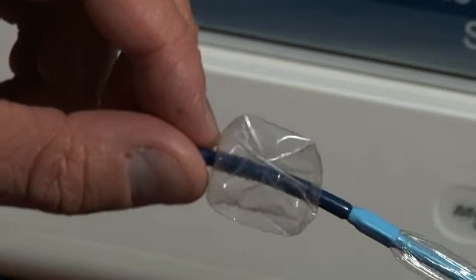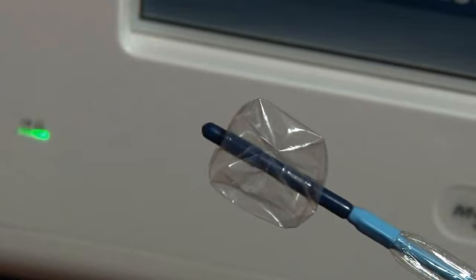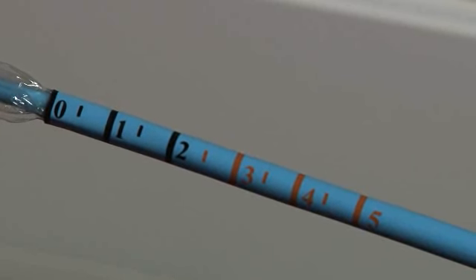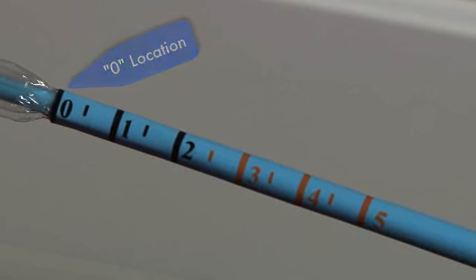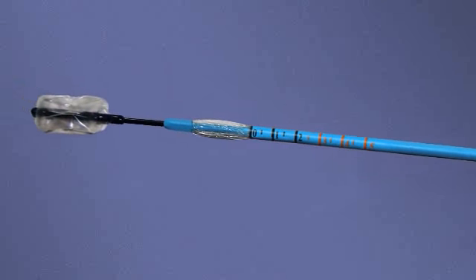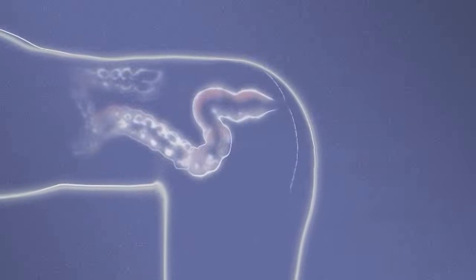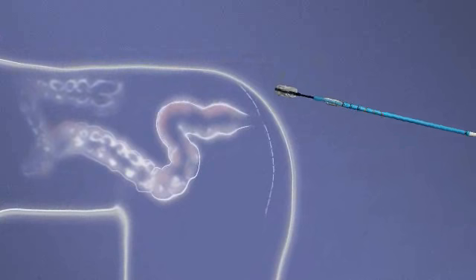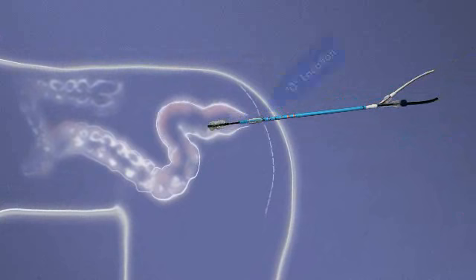The catheter features a soft, flexible tip, but has enough strength and firmness to be inserted without the use of your finger. Gently insert the catheter through the sphincter to the point where you would be located at the 0 location on the catheter. As the graphic shows, there are indicator lines on the catheter. They start at 0, then go to 1, 2, 3, 4, and 5. With a typical patient, the 4 anal canal balloons should be just inside the anal verge at catheter position 0. Anal canals range between 20 millimeters and 45 millimeters in length.